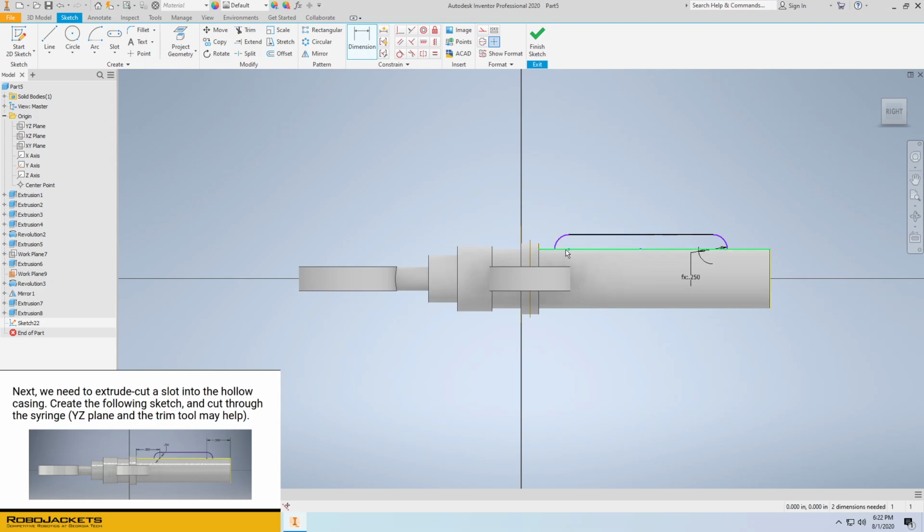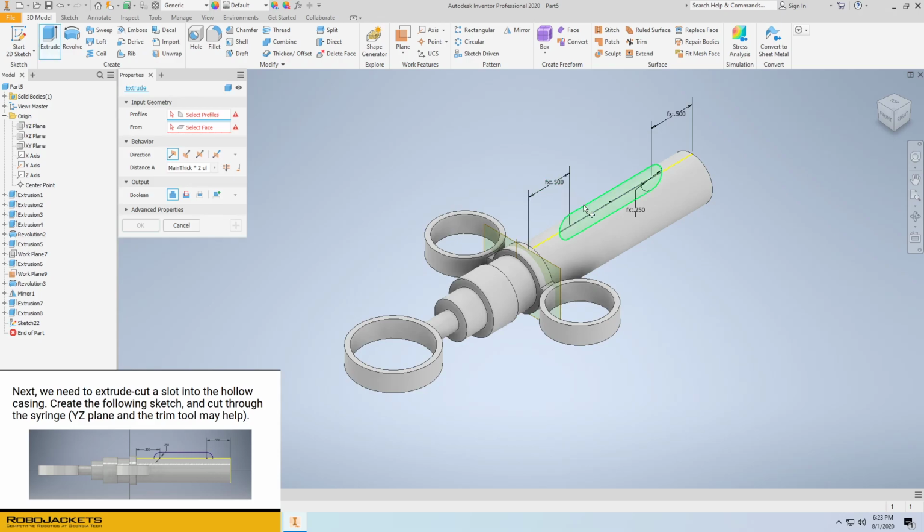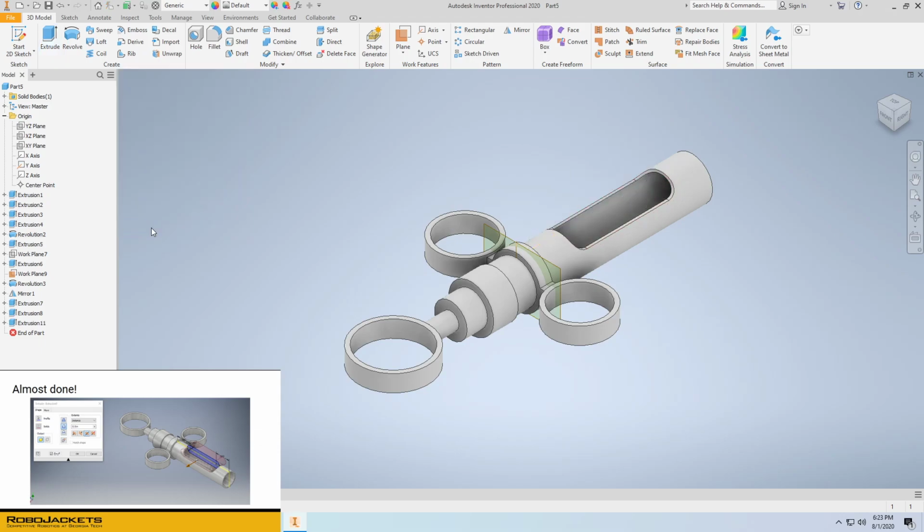Now we want the center point of each slot to be main thick times 2 away from each wall. So we'll do that one, do this one. There's our slot. Go ahead and finish up the sketch. And we'll use the extrusion tool on this new sketch to push it both ways. We want to cut out main thick times 2. Remember, main thickness is 0.25. We want the extents to be 0.5. So that's main thick times 2. And there's our cutout.